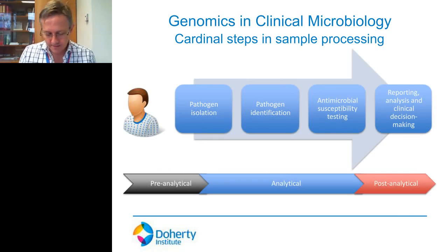Okay, so I've talked mainly to this point about how genomics will help us in public health microbiology, that is in foodborne disease, characterising isolates that are referred for molecular typing and looking at infection control interventions. But there's also a discussion about the role of genomics in a clinical microbiology lab. And if you think about this, I think in future this will most likely be the case, but there's probably a lot further work to be done before it would be immediately transferable.